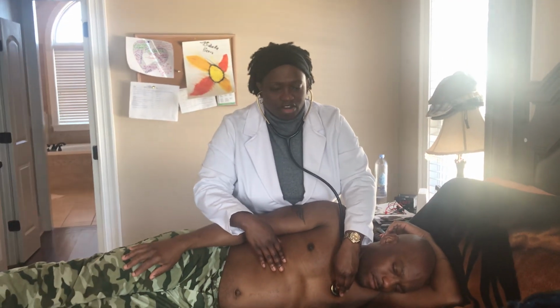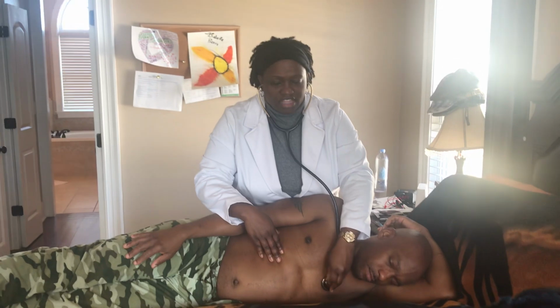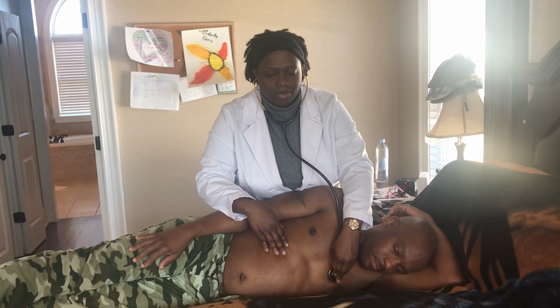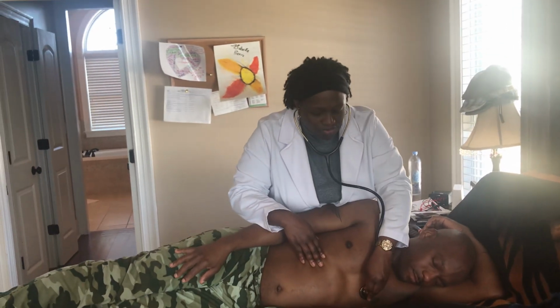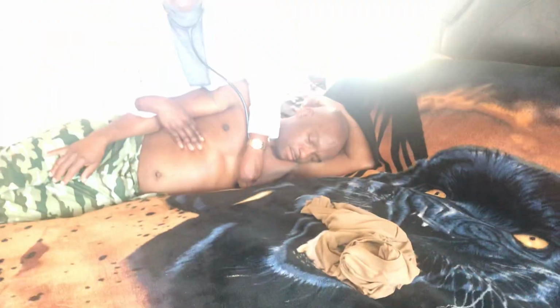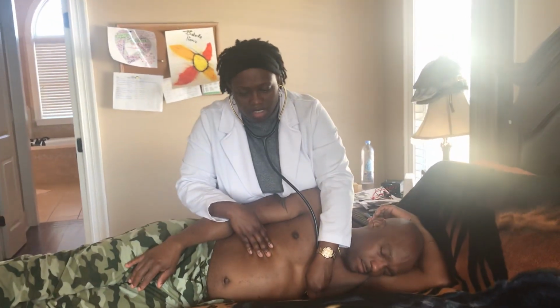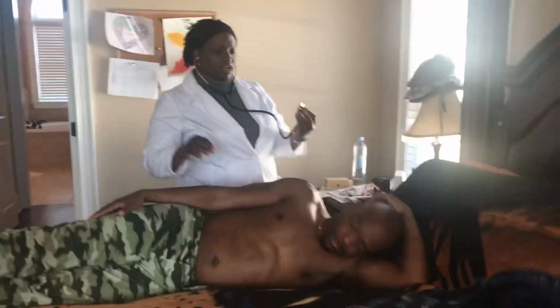That's the second intercostal space, left sternal border, the pulmonic region. Now I'm going down to the third intercostal space, left sternal border, Erb's point. That sounds good. The fourth intercostal space, tricuspid area. And then the fifth intercostal space, midclavicular region. And I don't hear any murmurs, and that's what I'm checking for. Okay, you can turn back over. All right, and it looks like everything is good.